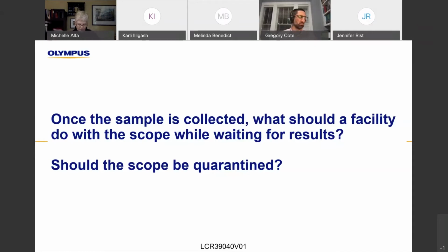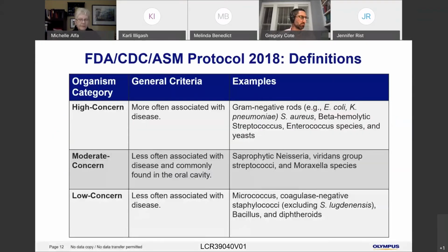Great. So I think, Michelle, in the last couple of slides and through discussion with both panelists, we've gone over a little bit of, you mentioned gram-negative, gram-positive organisms. You taught us what a CFU, a colony-forming unit, is. So I think it's time now to really dig down deep into the lab reports. And again, I think I mentioned this at the beginning.